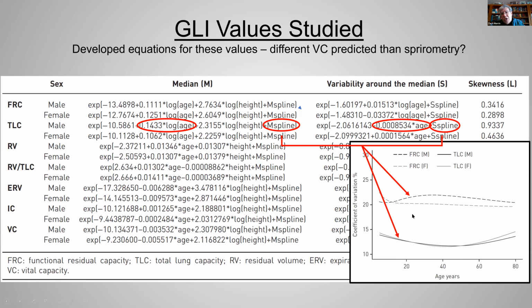Okay, what they did is they created an equation, and then you have to go to an Excel database table sheet at that point. And once you do that, then you have to look at that patient's age and find out how much you have to add or subtract from that regression equation line to kind of get it to fit this curve. As I mentioned last week, I'll repeat myself here. I'm not a statistician, but something just seems kind of weird about that when you have to go to that extreme to do that. That there's that much variation between, you know, aging instead of following more of a linear pattern.